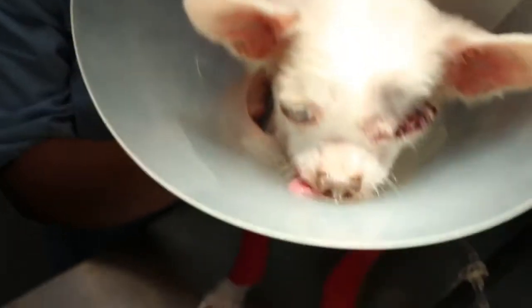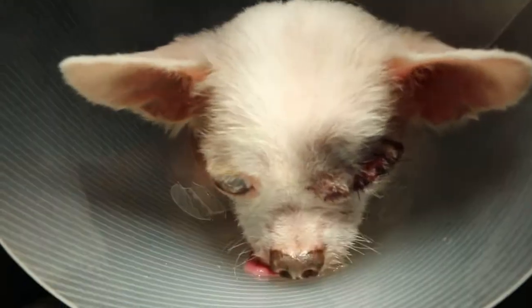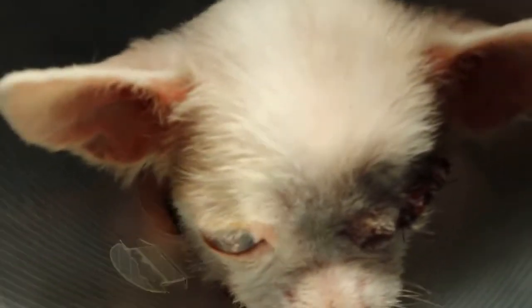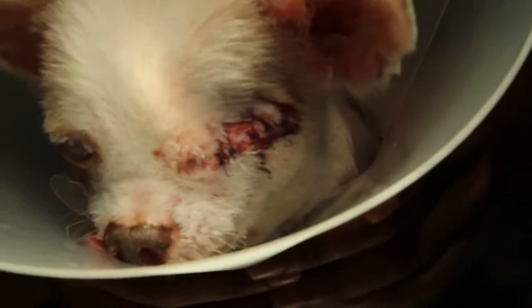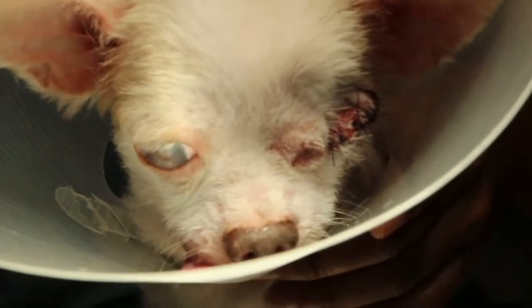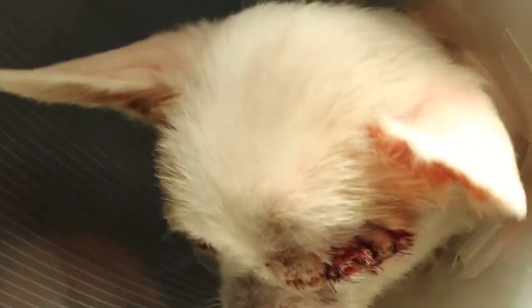Today is 5th November 2018. This is a video to show how this dog's surgery has been performed. This surgery is called enucleation, removal of the eyeball due to severe injury and pain. And I'm just describing the surgical procedures. This surgery was done about 1.5 hours ago.